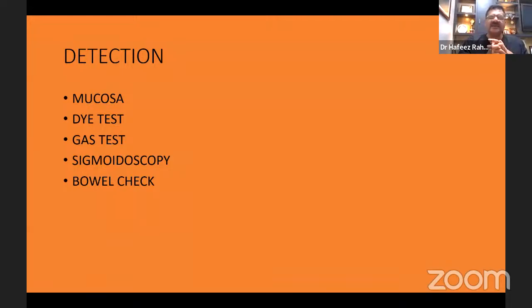These two things you have to be very clear on at every single point, and you should be able to clearly identify mucosa. For this, one of the most important things is to have a very good camera and keep your camera clean always. This is the problem I have with all the smoke which comes when you dissect. Sometimes you fail to identify the look of the mucosa. So we always look at the tissue and identify structure, so that look of the mucosa goes on.